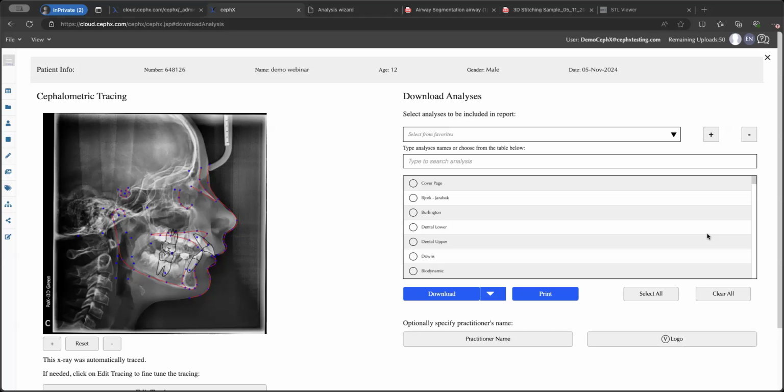It's only monthly. The monthly cost depends on which services you want to use, 2D or 3D, and also depends on how many cases you want to send. When we send that email, we will also send you access to the pricing page, which will tell you exactly how much each plan will cost you for sending 2D, sending 3D, and sending multiple cases.